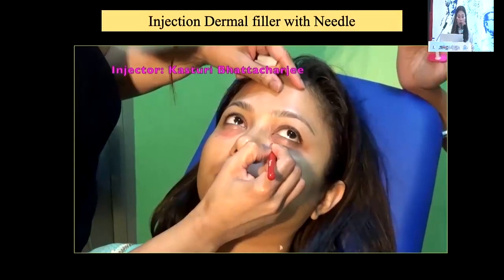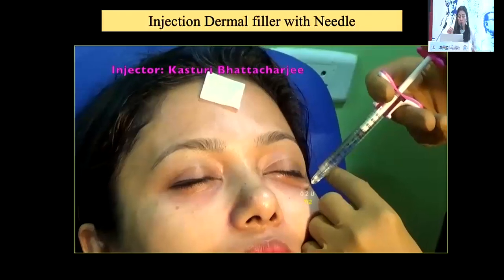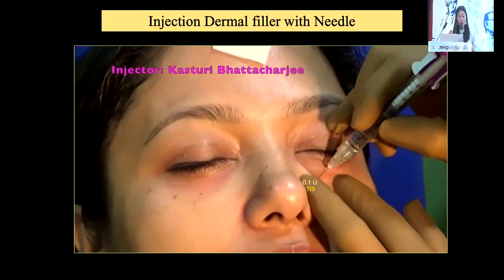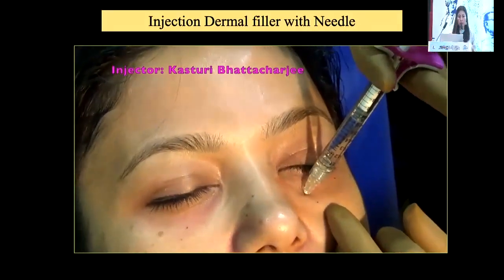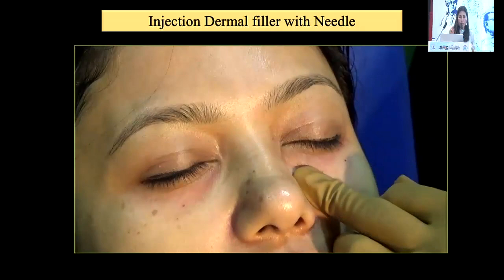So in the same way you mark the infraorbital rim, and then the most important thing, when you do a needle injection, you have to aspirate. The time of aspiration varies from 8 seconds to 39 seconds, but I usually wait for approximately 12 seconds before I inject the dermal filler. So a very slow, very small amount needs to be injected, and you will see the results immediately on the table.